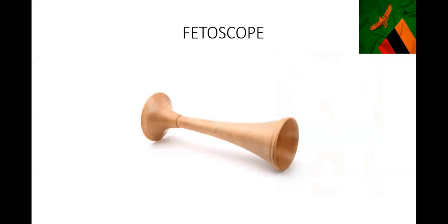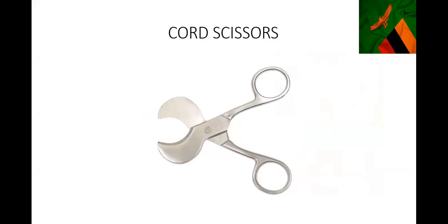Everyone knows what this is - we don't need to go around talking about it. This is your fetoscope. This is a cord scissors. A cord scissors should never be missed because it has that round cutting part. We don't cut the cord with a straight scissors because it slides on the cord. This cord scissors is shaped so that when you are cutting a round cord, it doesn't slide over it - it just cuts it.